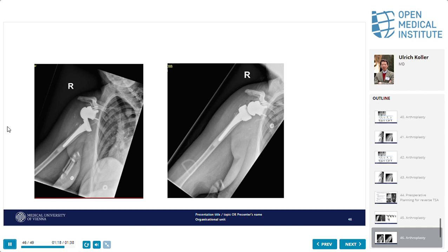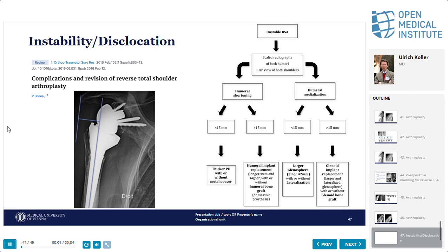So really crazy. But this was just due to the fact that I think the whole tissue needs its time to get long again, and when it got its length, then in most cases it's too less tight. There's also an interesting paper by Pascal Boileau with a very good workflow on what you have to think about.